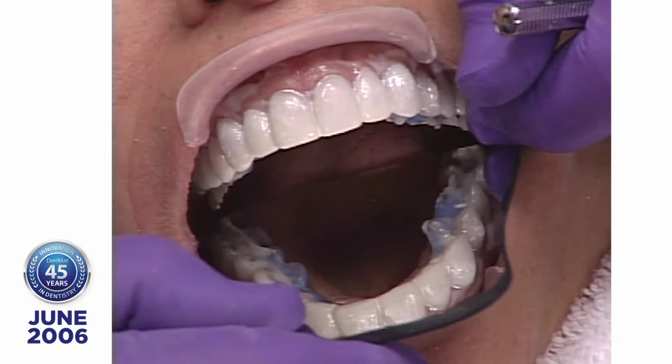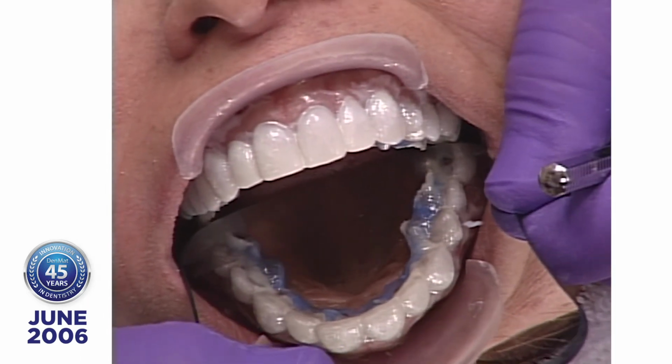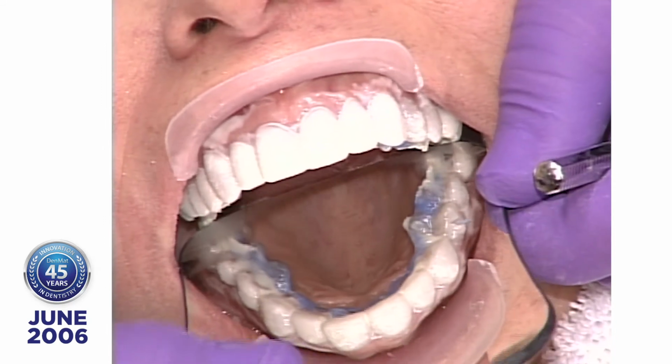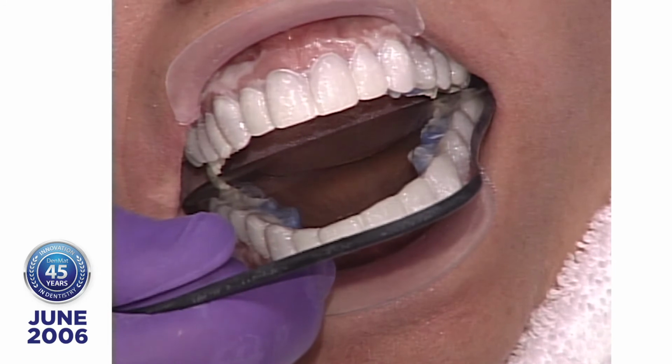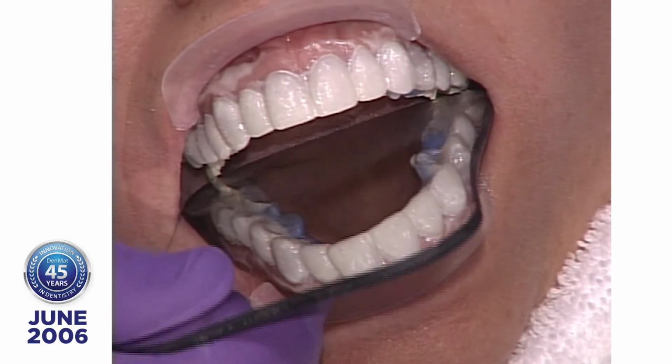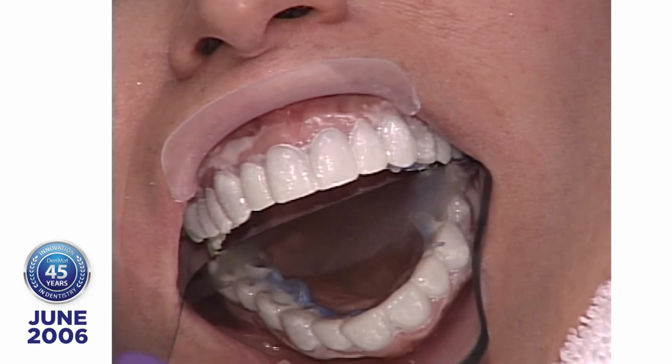So let's take a look at the backside here. Now you see wherever you got that blue, oh, that's the other thing. Look at that stuff hanging down from the molar. Believe it or not, that has polymerized. It came in touch with the Tenure S, and before we could wipe it off, it came out.